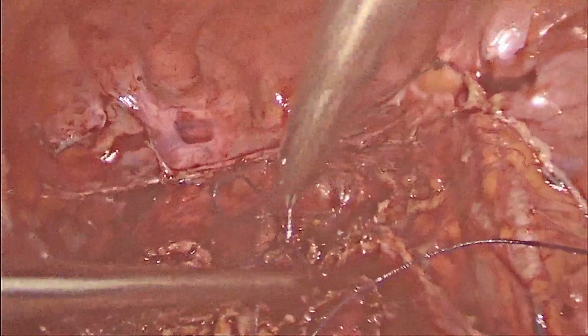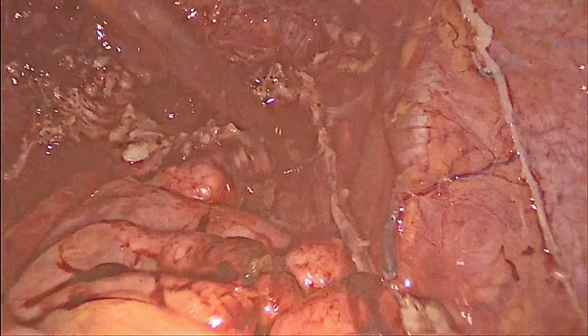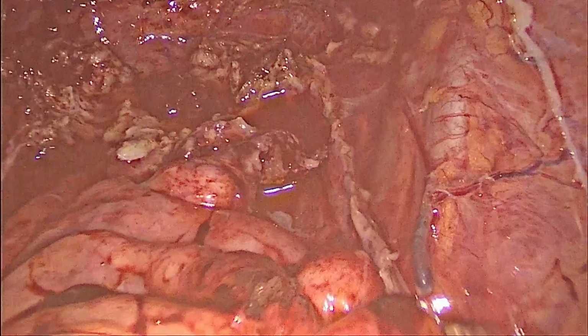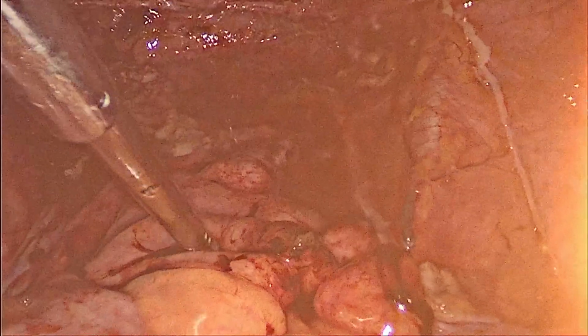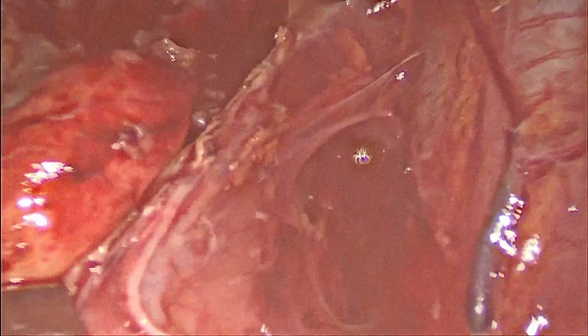This completes the surgery, and later we just have to identify the safety of the ureter as a completion procedure at the end of the surgery, and the bladder. That is the right side ureter, which is usually identified by its peristalsis, and that is the left side, which is completely dissected and kept.